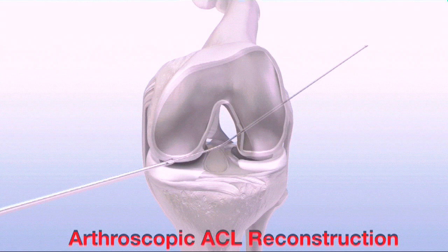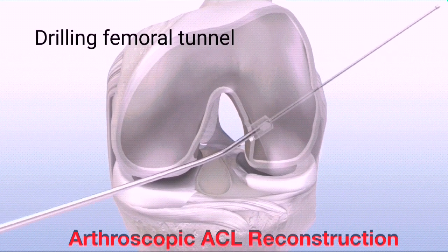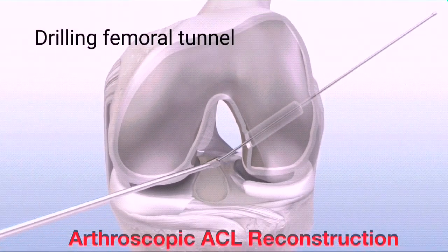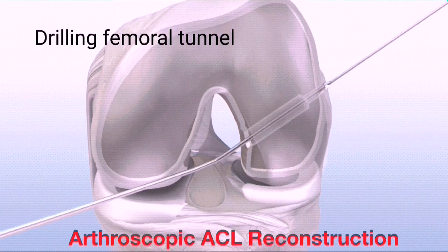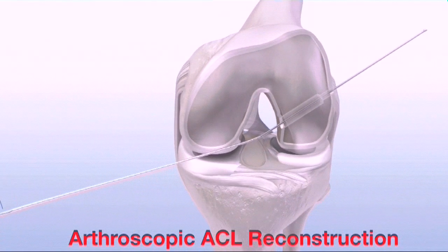Next, insert the GraftMax FlexSentinel reamer over the FlexExact pin, keeping the cutting flute away from the femoral condyle. Advance the FlexSentinel to ream the femoral socket. Remove the FlexSentinel from the joint. Then advance the GraftMax Flex channel reamer through the lateral cortex. Remove the Flex channel reamer, leaving the FlexExact pin to be used to position a passing suture.